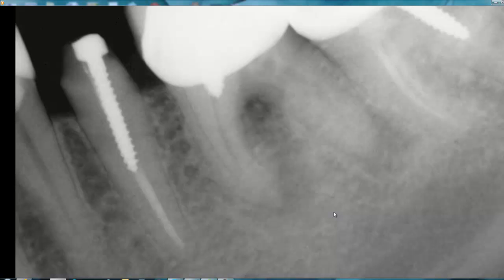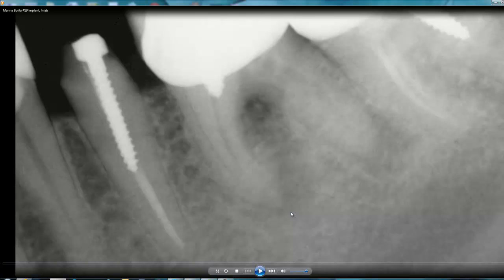The patient came to me with an emergency on number 19. It was a failed root canal — you can see on the x-ray — and also the post was in place but there is no root canal filling done on number 18 at all in the root canal space. The patient also had a loose crown on number 20. On the x-ray we can see what looks like a vertical fracture with a rarefaction area, and that's probably mostly hopeless. So we informed the patient about the possibility of extraction and placing an implant, or maybe a site preservation followed by a delayed implant placement in three months.